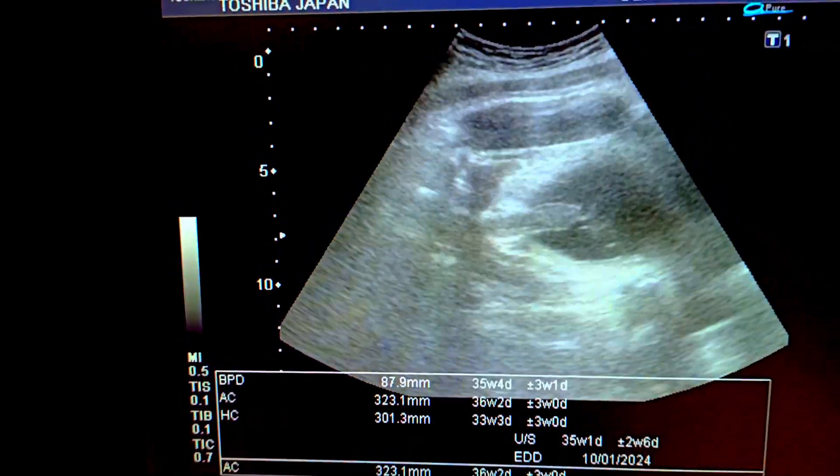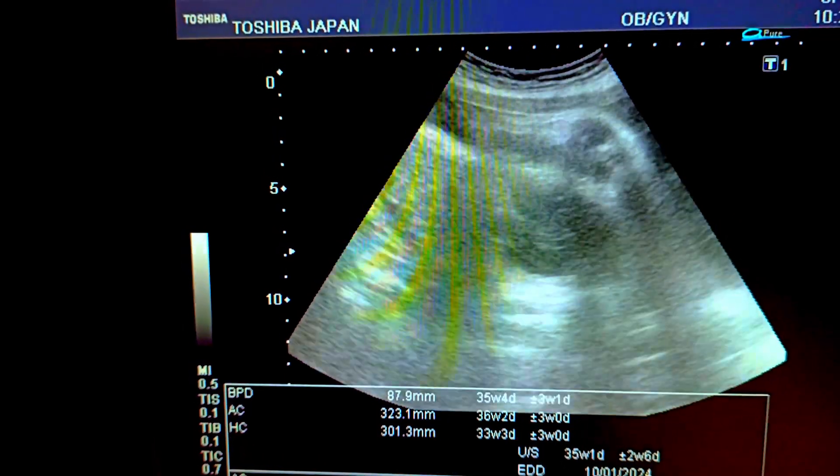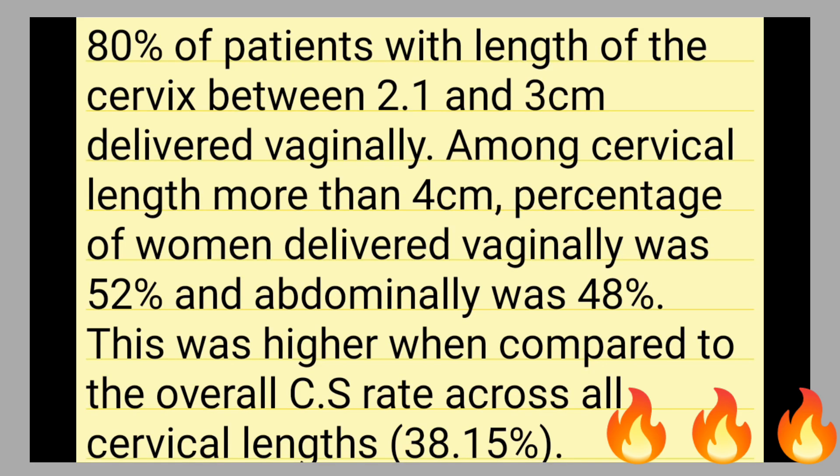Measuring the cervix is important because in 80 percent of patients with a cervical length between 2 and 3 centimeters, they deliver normally. Among those with cervical length more than 4 centimeters, 52 percent delivered vaginally and 48 percent abdominally. Cervical length can predict the way of delivery.